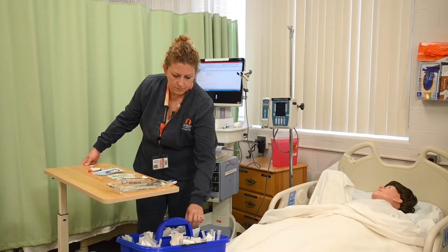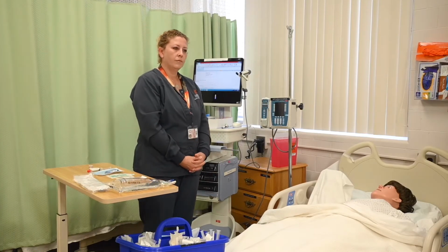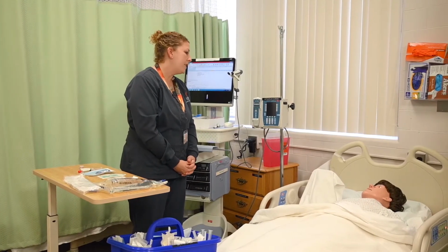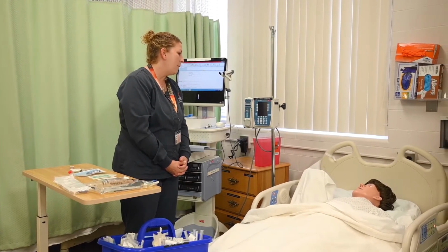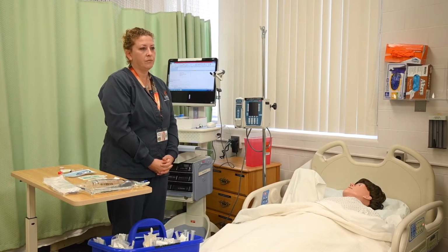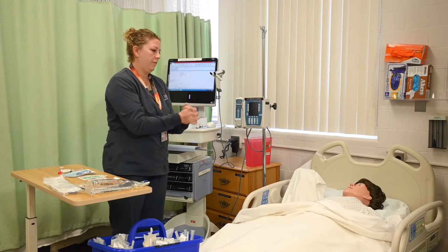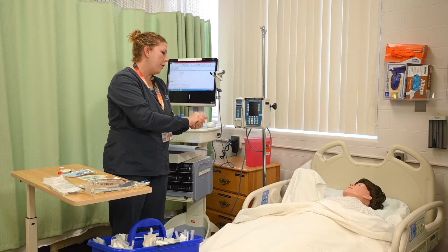Okay, introduce herself to the patient and family if necessary, and state name and credentials. Hi, I'm Sarah. I'm going to be your student nurse today. I'll be putting in an IV catheter. There's no family present. Perform hand hygiene, and provide patient privacy. I'm going to pull your curtain for privacy.